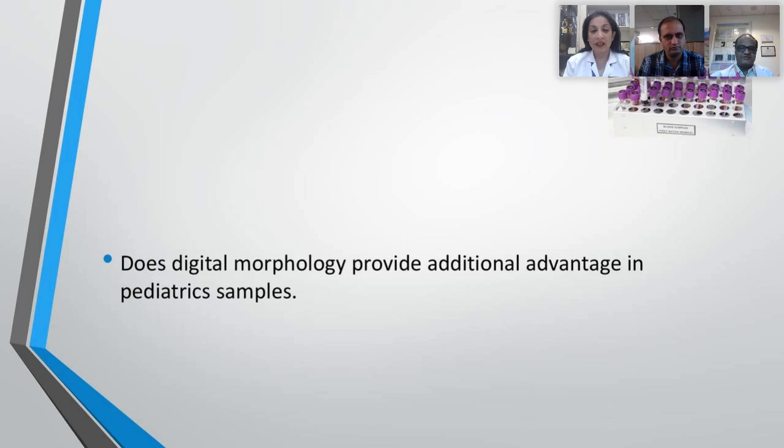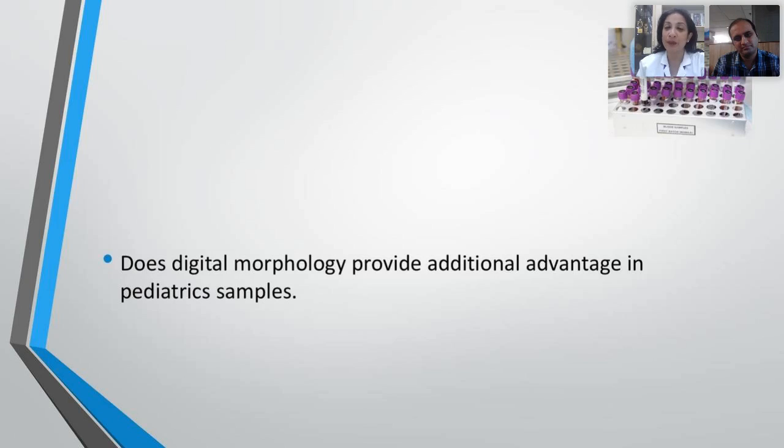Ma'am, please. Yeah, Ankur, before that I would like to share the experience that we had during the validation, to answer your last question on low cell count as well. When we did the validation, we were able to demonstrate that the instrument yielded reproducible pre-classification results for neutrophil, lymphocyte, monocyte and eosinophil beautifully, including the blast. As Dr. Srinivasan mentioned, it's very sensitive for blast pickup.